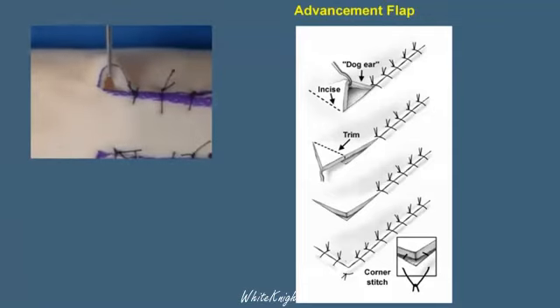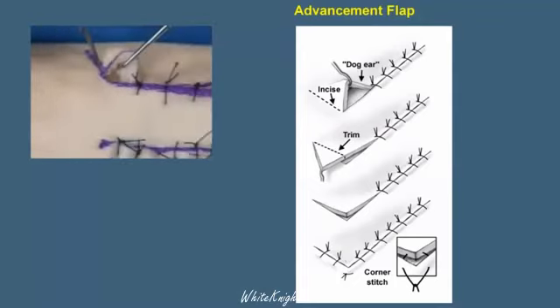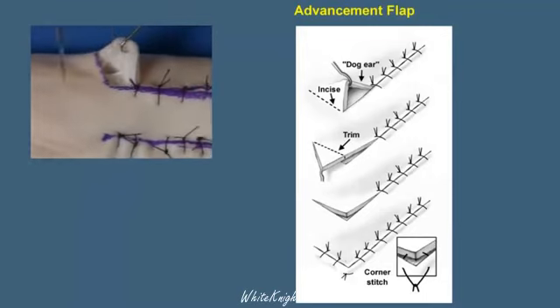A single hook is placed in the dog ear, and the triangle that is formed can easily be seen. It is then marked with a surgical marking pen. An incision is made perpendicular to the skin edge so that we can mark out the point of a triangle.